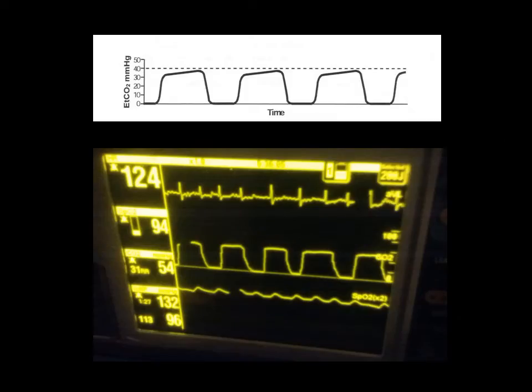So this is a patient that we had, if you notice, he is breathing 31 times a minute. His CO2 is very high, 54. And if you notice, there's the 0. The scale is a 100 scale. And his SpO2 is 94. So without even knowing anything about it, he's breathing 31 times a minute.